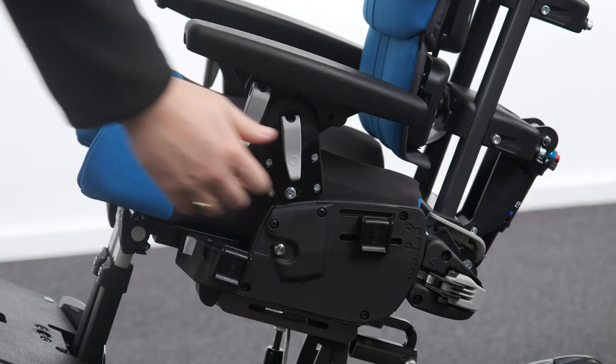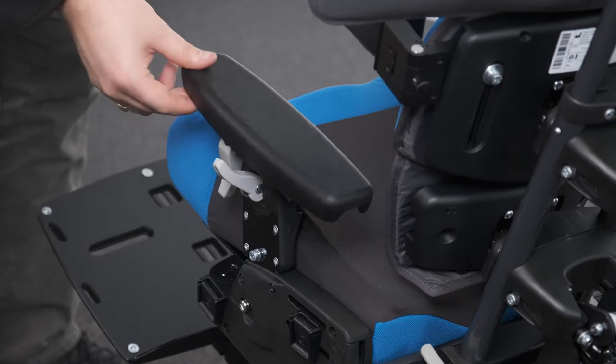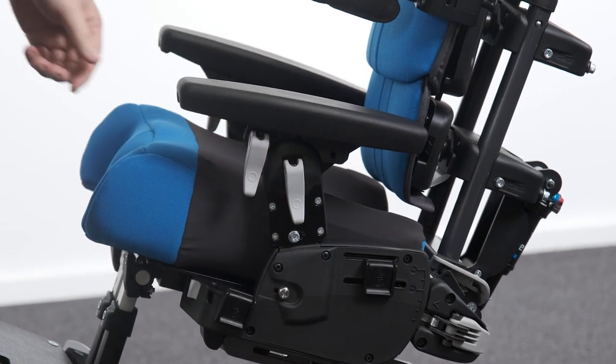Adjusting armrest angle. To adjust the armrest angle, locate the cam lever in the centre of the armrest. Raise the cam lever to unlock and change the angle of the armrest to the desired position. Secure by lowering the cam lever to the locked position.